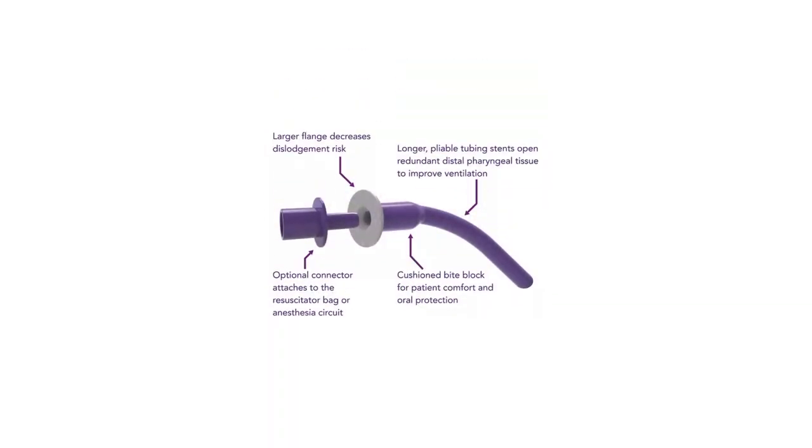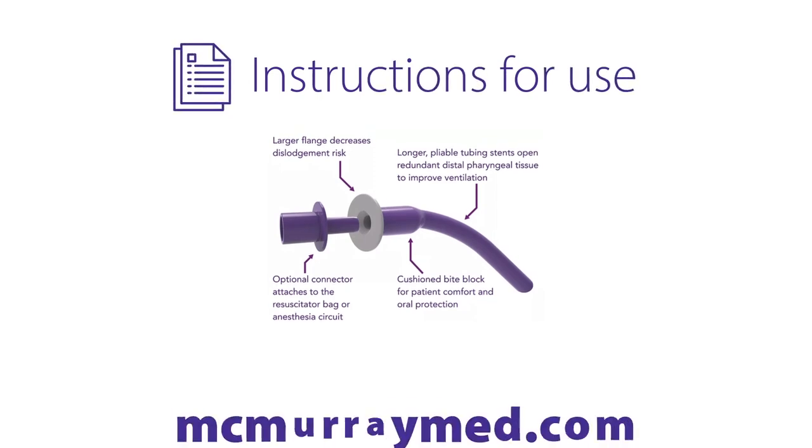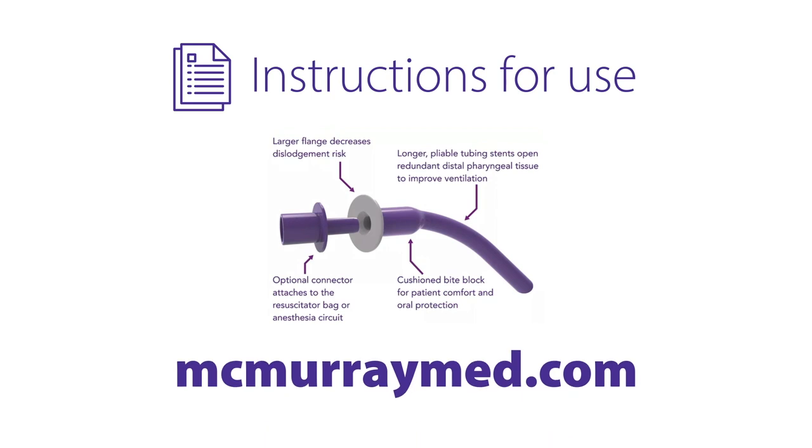For potential complications and best practices, please refer to the Instructions for Use insert, located in each MEA box or at McMurrayMed.com.